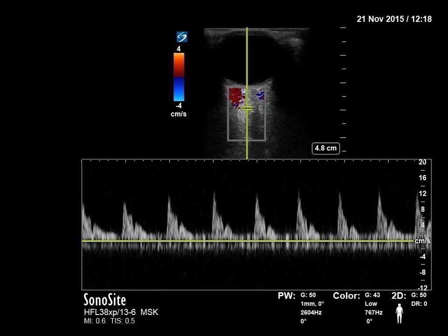Another problem was that TCD was done by a technician, and being a doctor, probably you guys have more understanding. So the interpretation power of a physician might be better. So that is how this is getting reverted back to the mainstream.